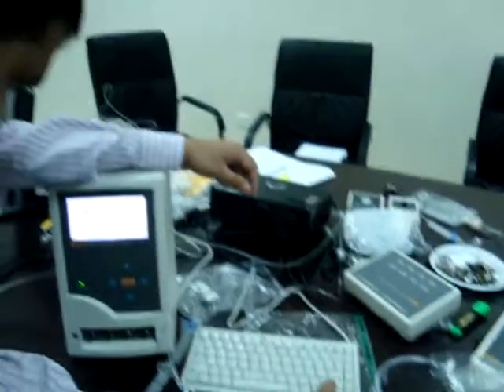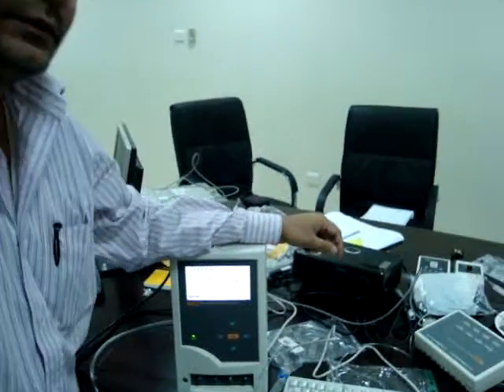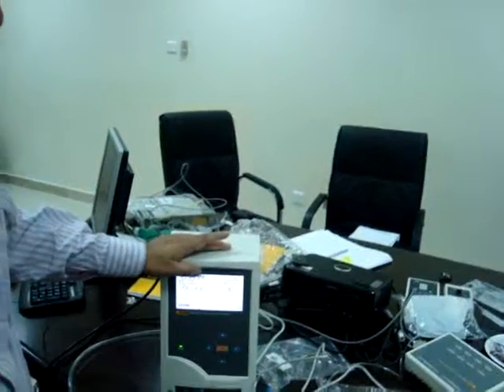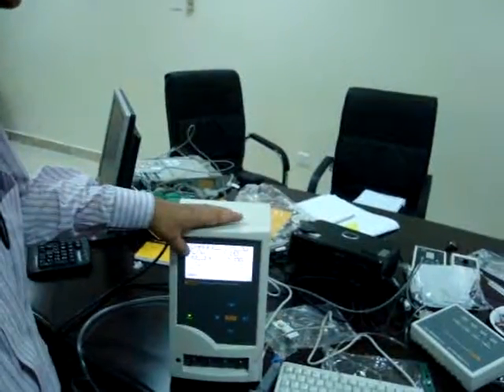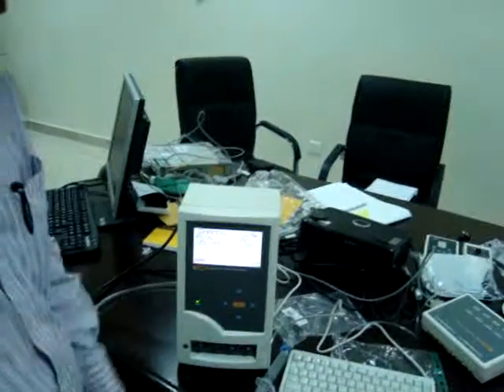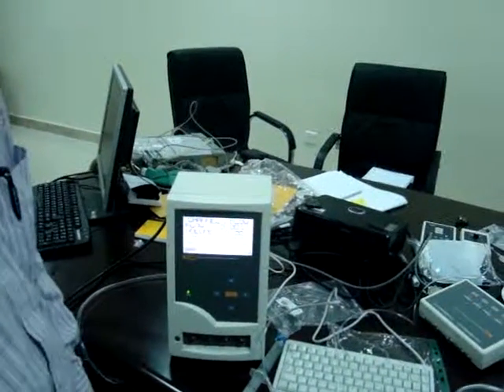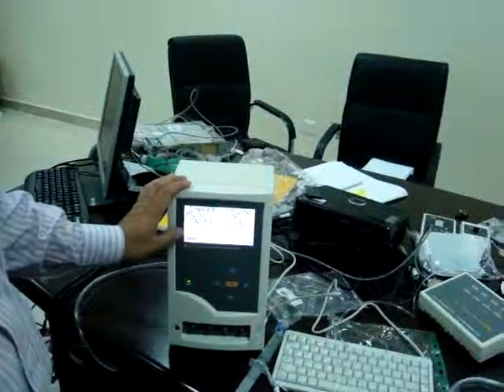Then you can set the flow parameters. What average flow you are giving, how much volume you want, what is the elapsed time, and the back pressure. But Mr. Yunus, this flow volume depends on the user. There is no normal range.